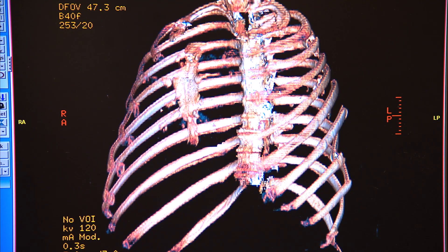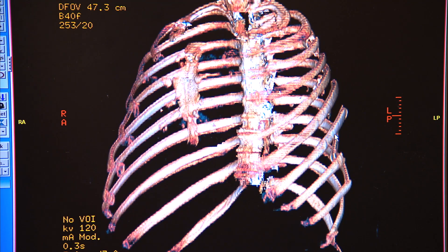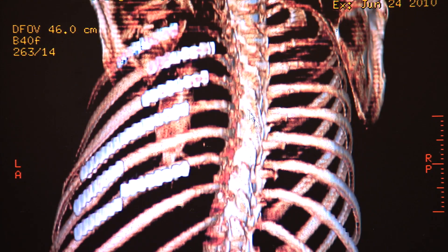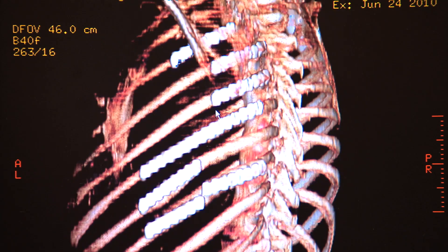Even with him intubated and under sedation and pain medicines, still very, very painful. You can see the multiple breaks all along his chest wall. This is similar to his preoperative reconstructed CT scan, and you can see these plates in a different configuration — highlighting where these plates are along his ribs.